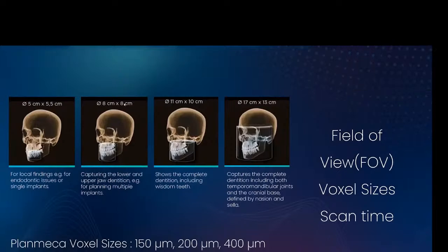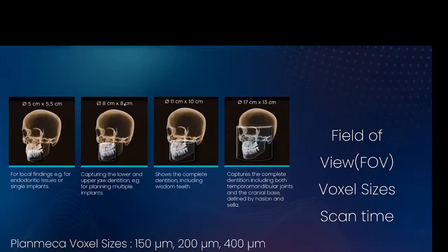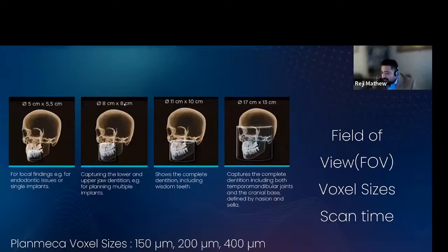If you have a missed canal, a root fracture, a small radiolucency at the root apex, or some accessory canals in the root, all this is great, because with a great spatial resolution and with a low voxel size and low field of view, you can see those structures very clearly. So that's a great thing.